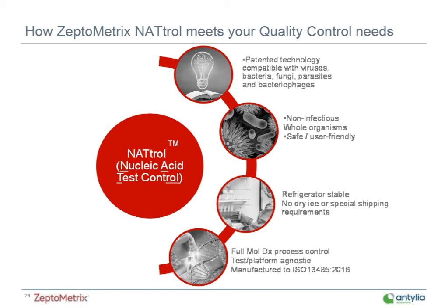Like I mentioned, a lot of controls available on the market are frozen. So with that, you have to really be careful of the amount of freeze thaws that you do, so you don't have to worry about the integrity of the material. Or a lot of them are also lyophilized, and obviously lyophilization requires a reconstitution, and that requires a little bit more care and pipetting in order to ensure that the correct concentration of the analyte is being used.